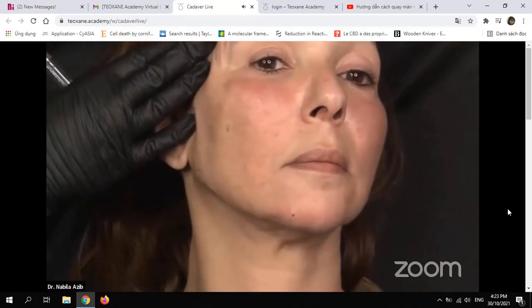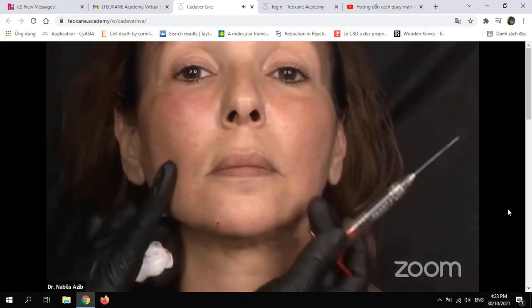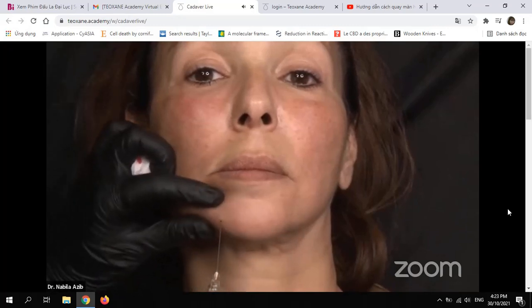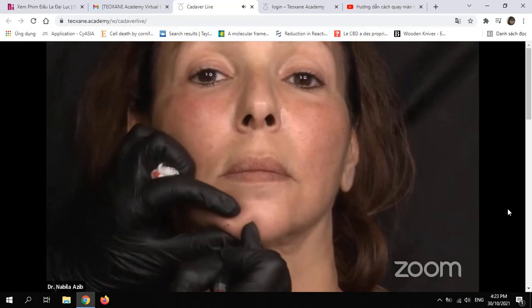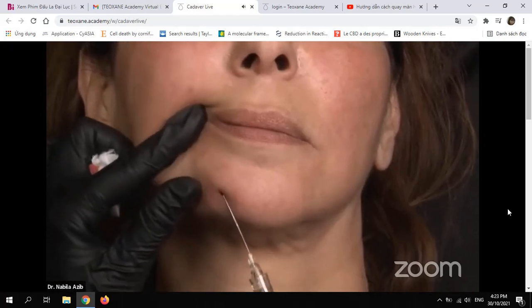Yes, for sure. But look at her lateral commissure, which is drooping here. Now, if I push the jaw, you can see that would be my limit of injection. So from the same entry point, being superficial to avoid the labiomental artery, and to have a nice lifting effect.